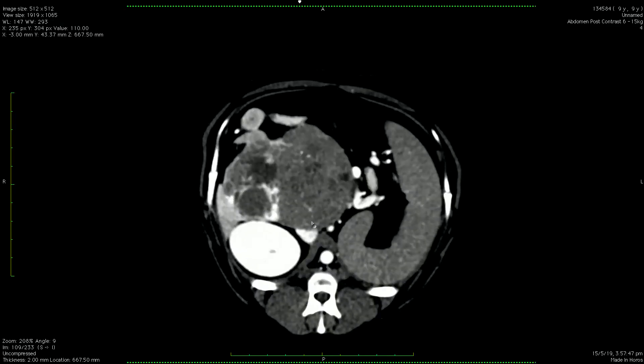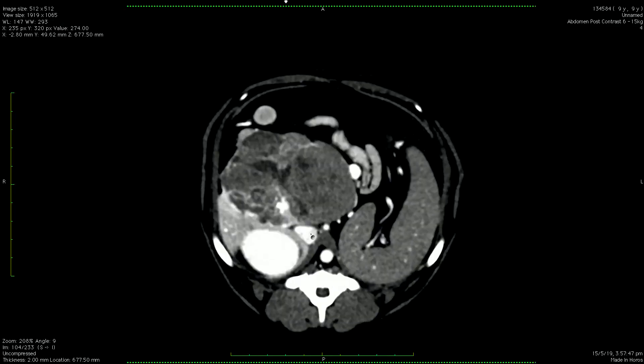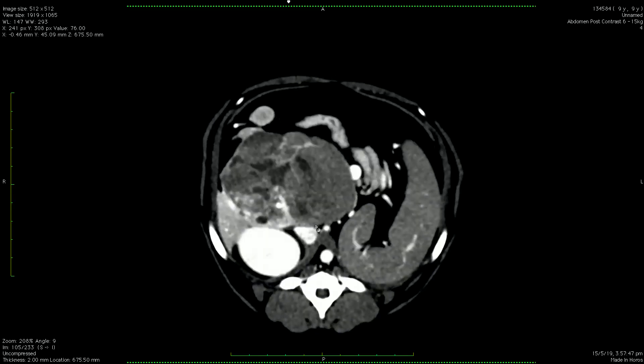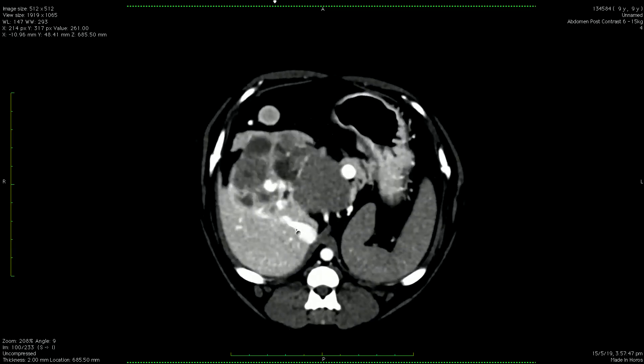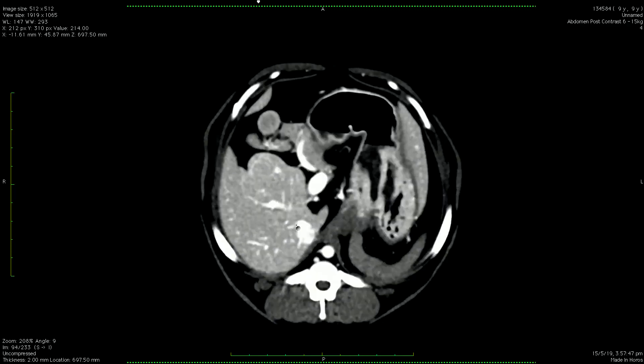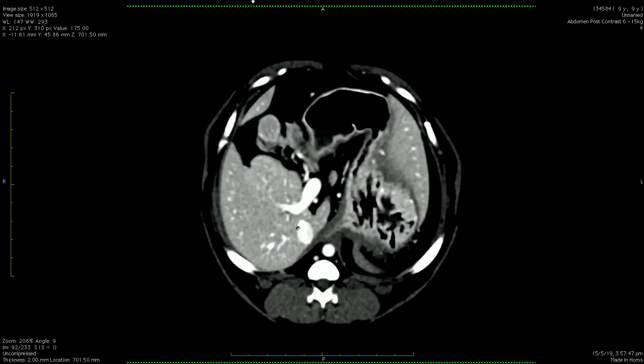So as we dissected cranially along here, we peeled the vena cava off the mass and came around medially. You can see the portal vein sitting right here, and that was attached to the mass as well, so I had to peel the portal vein off. Then the hepatic artery was sitting right up against the mass as well, so I had to dissect the hepatic artery off, dissect the vena cava off, and then get up into the liver lobe right here. I was able to ligasure right through that large blood vessel and separate that off.